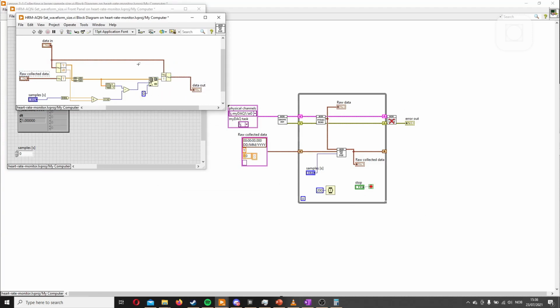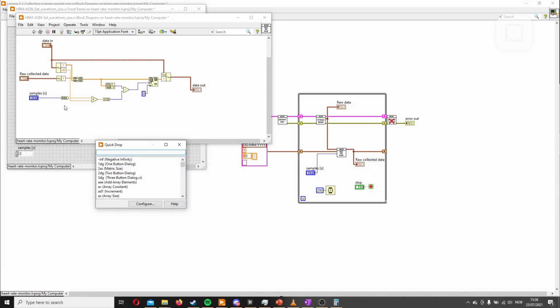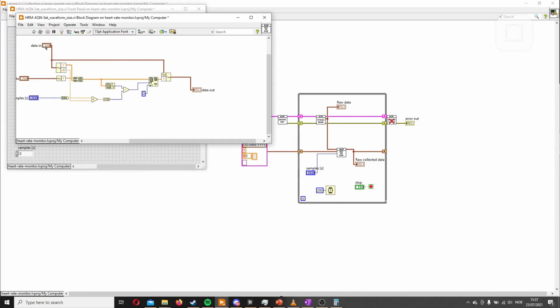And another thing I like to do with these VIs is to get the names on the side. And you do this by holding control, pressing space, and without letting control go, you press T, and all of these go here. I just think that looks nicer. So it was holding control, pressing space, and then while holding control, pressing T.